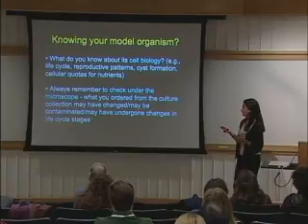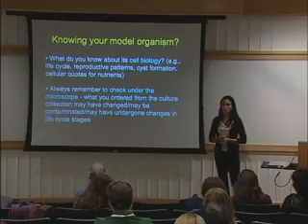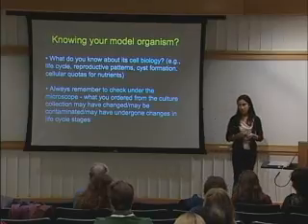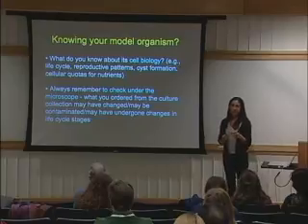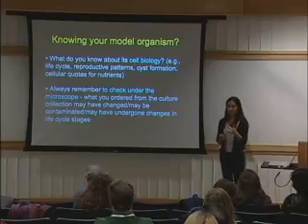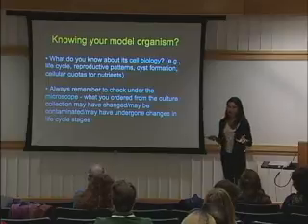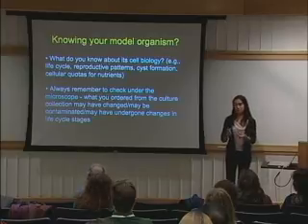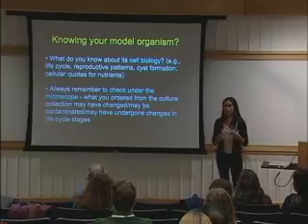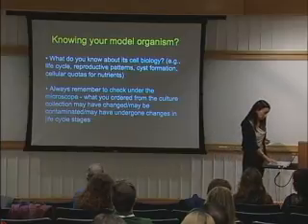And you also need to check under the microscope if you don't work with calcifiers, if you work with other non-calcifying algae. You also need to know that the original state, when you got the cells from the culture collection, is the same as what you have now. In all labs, we've all had problems with contamination, with parasites, with flagellates, or sometimes bacteria can affect your culture. So you need to keep an eye on all these things.